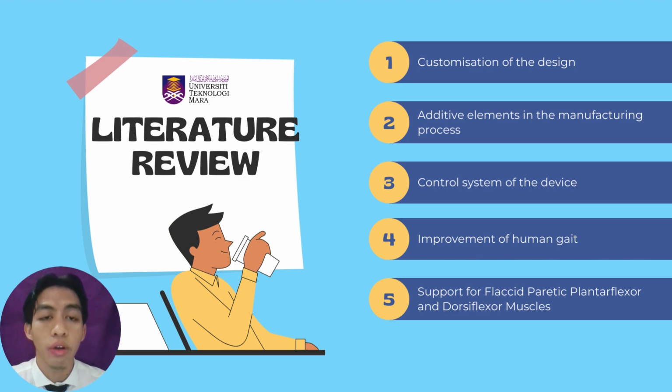The third is control system of the device. In this project, the hardware design consists of passive elements and stiff or compliant actuators, whereas the main component in the software design is the design of a control algorithm. The purpose of this system is to stabilize the actuated ankle foot orthosis mechanism since the system is subject to an unknown disturbance brought on by ground reaction force and foot weight.